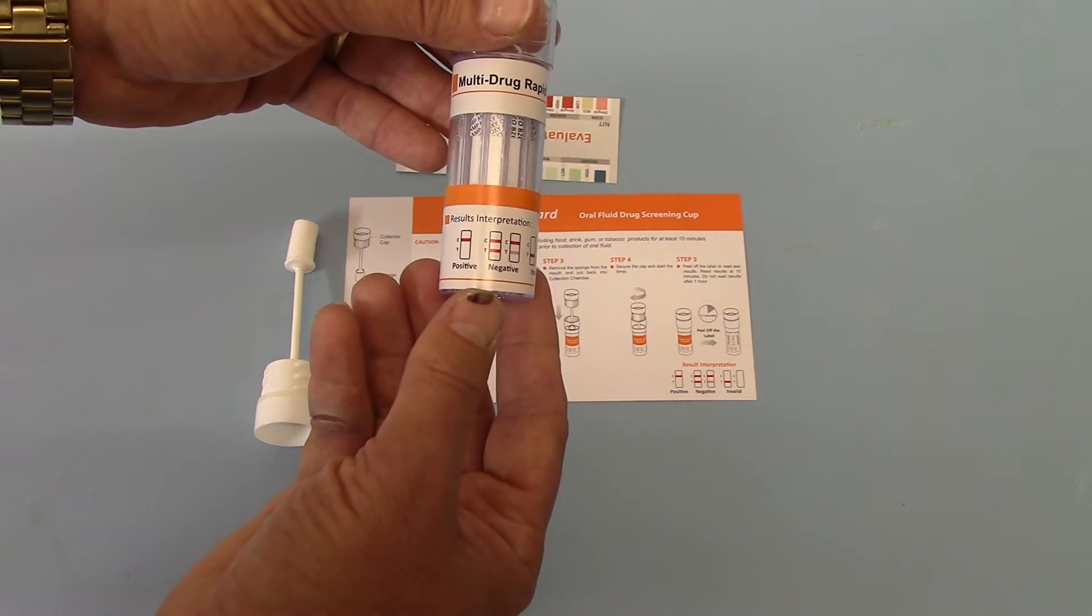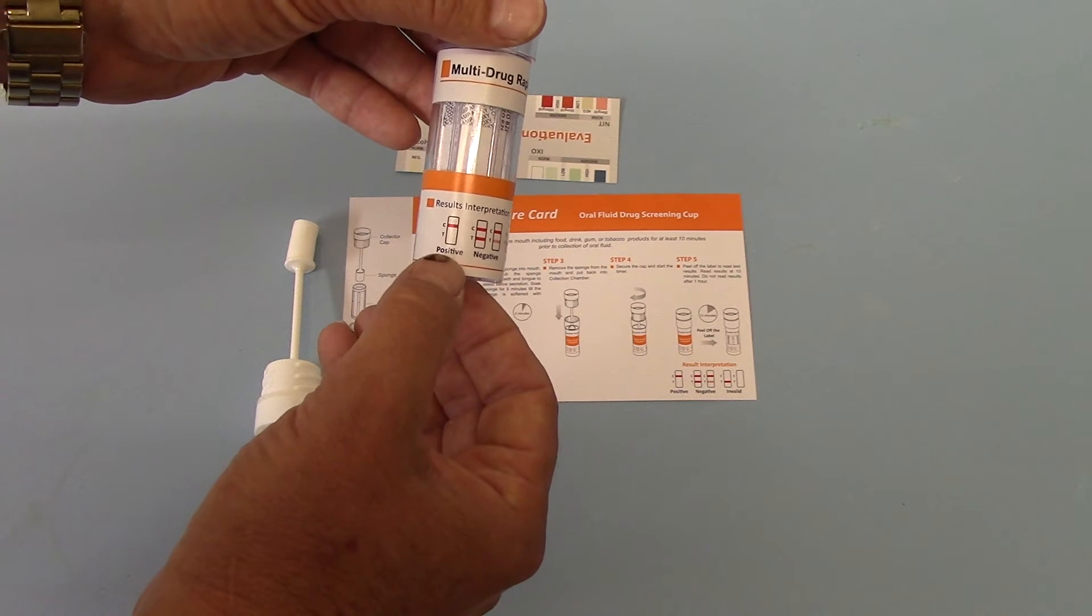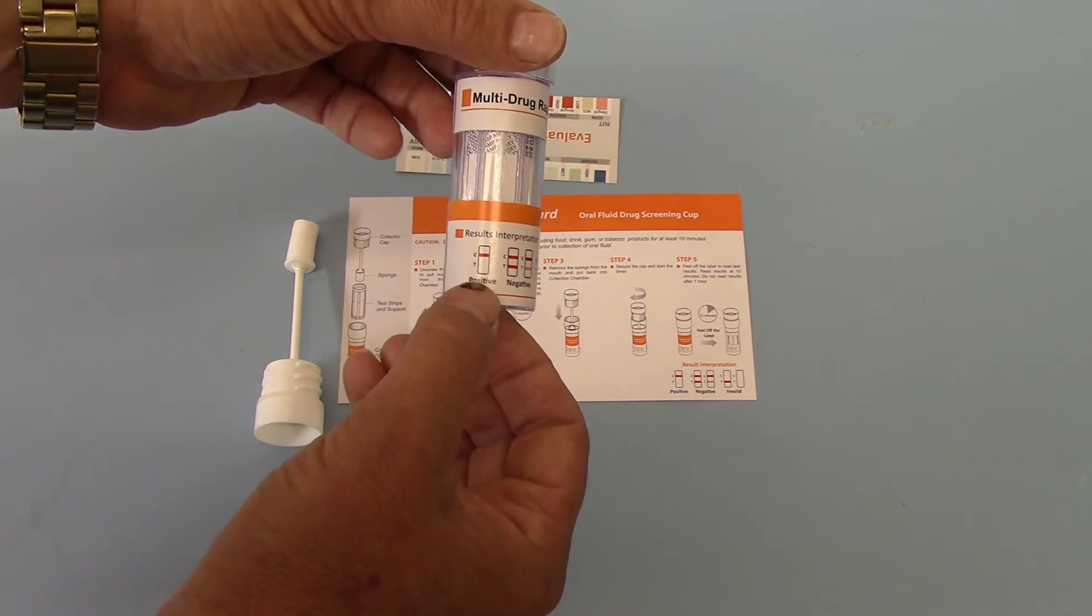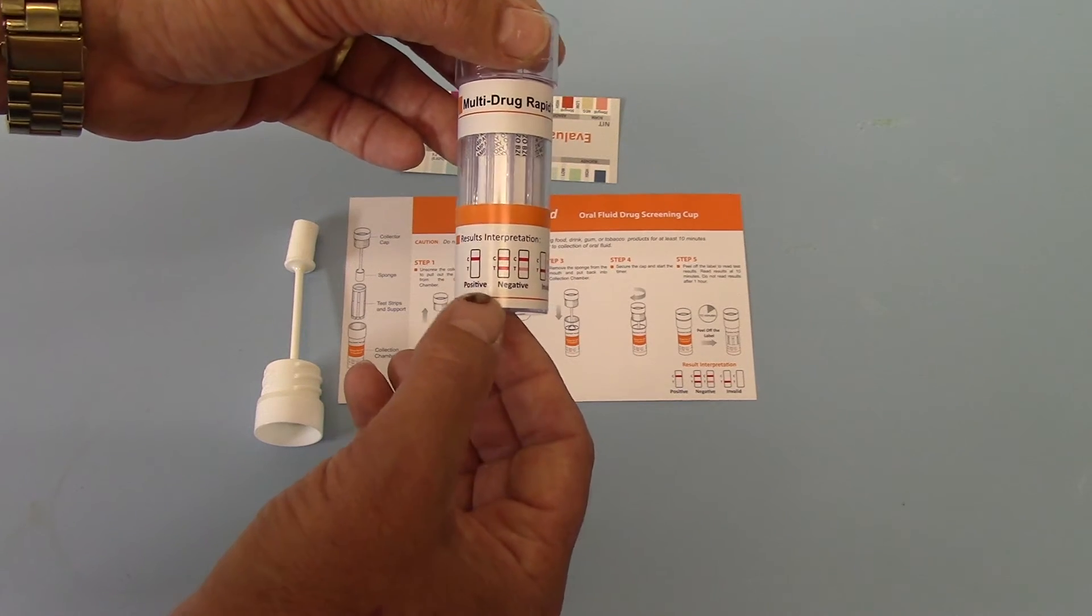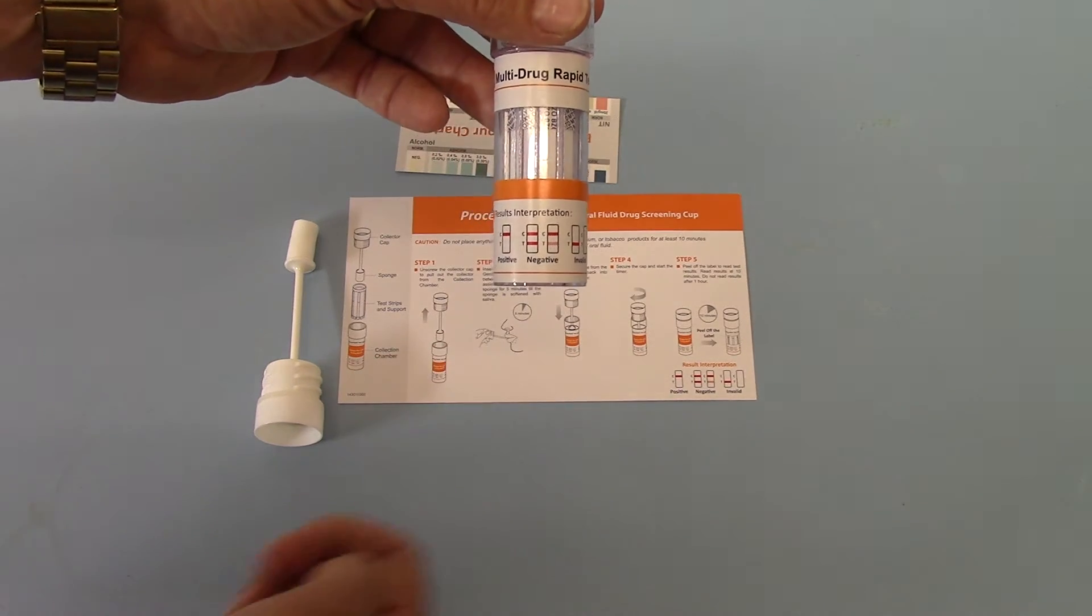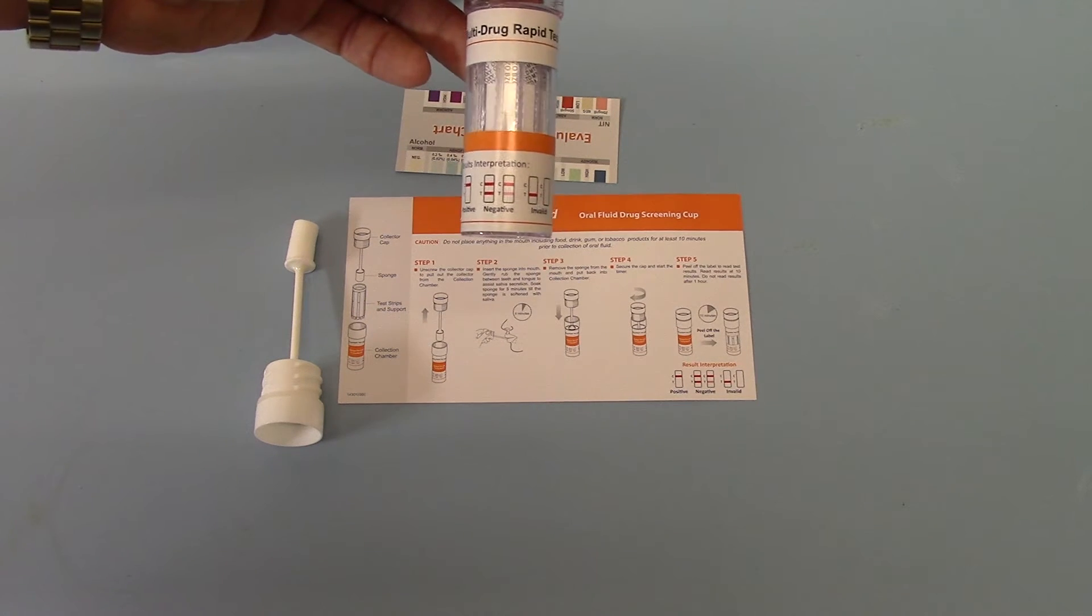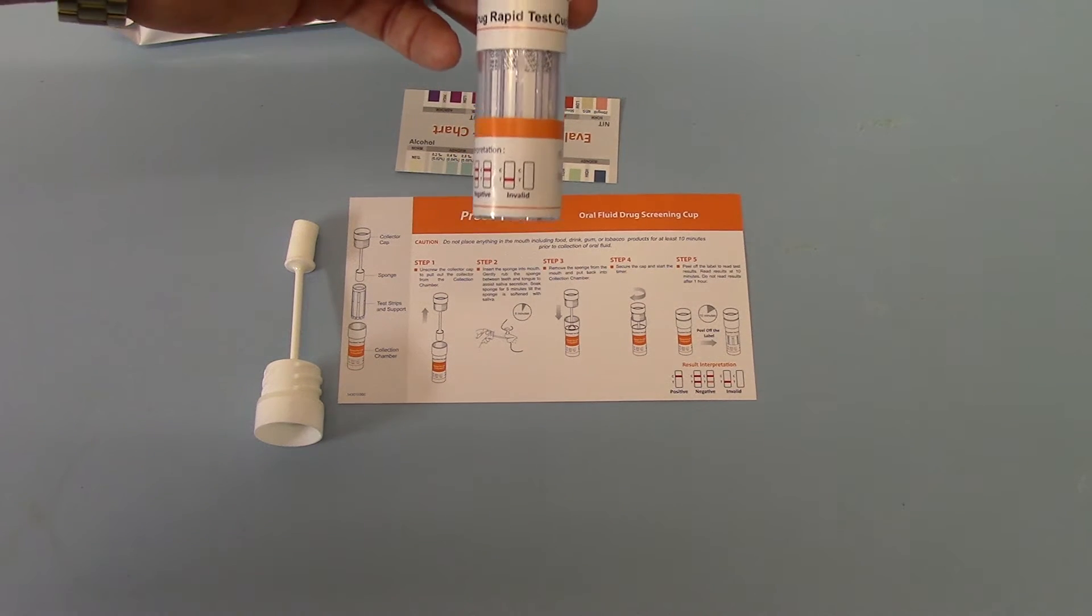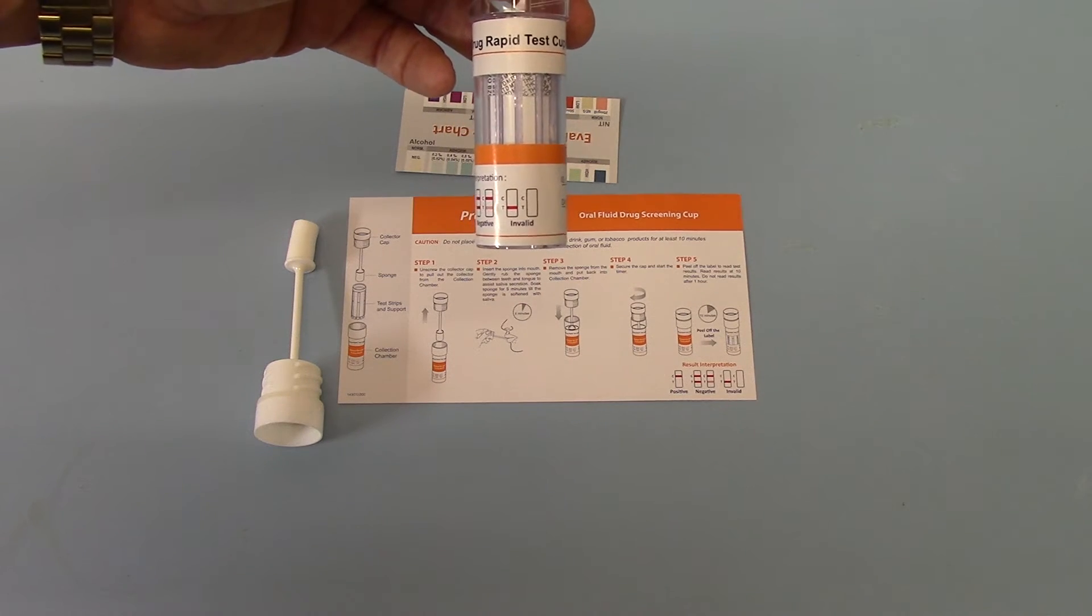On the side of the test barrel are result interpretation guidances, with a positive result being indicated by a control line but a completely absent test line at the read time, and then a negative result being indicated by the presence of a test line, whether it's thin, faint or very discreet. Invalid results would be where either no test lines or control lines show or no control line is shown.